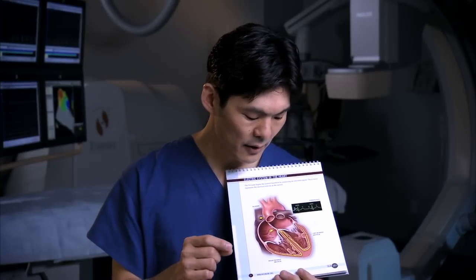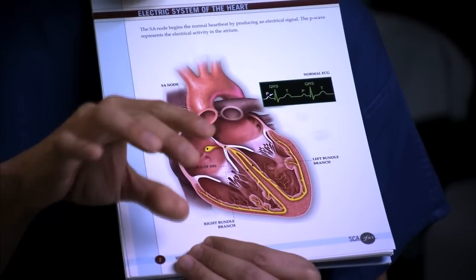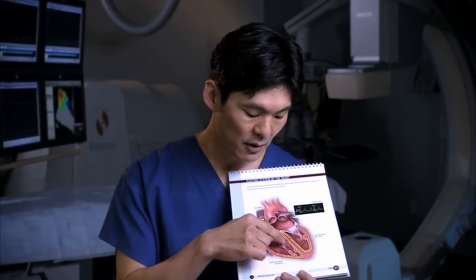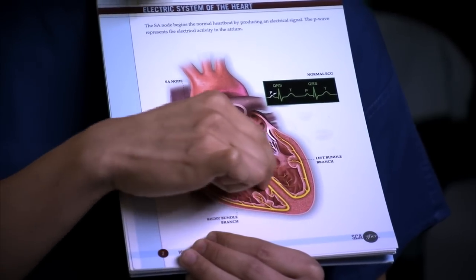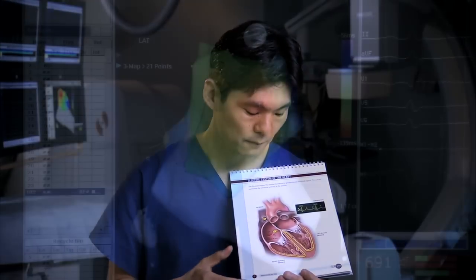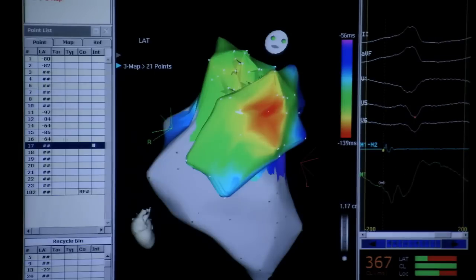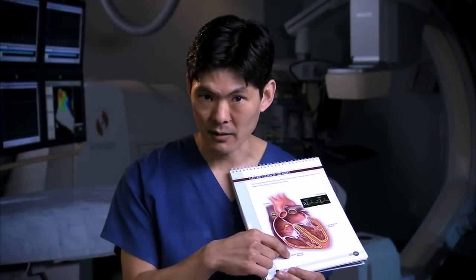Ventricular tachycardia a lot of times happens from a spot or focus within the lower chamber that essentially starts to act up and starts to run off on its own. Another reason for developing ventricular tachycardia is that electrical activity can get stuck in a loop, and it goes around in a short circuit, usually involving areas that are scarred within the ventricle. Ventricular tachycardia ablation is all about finding the spot or the short circuit that is causing the rhythm disturbance, and using catheter-based technology we find and eliminate the cause.